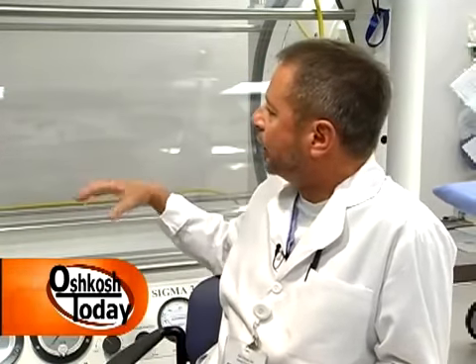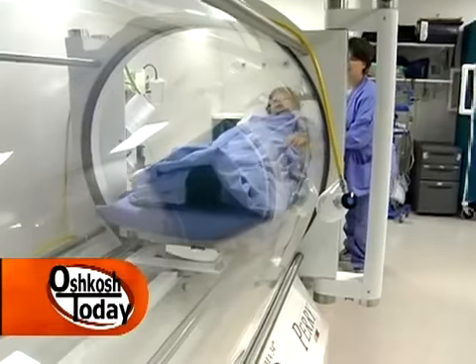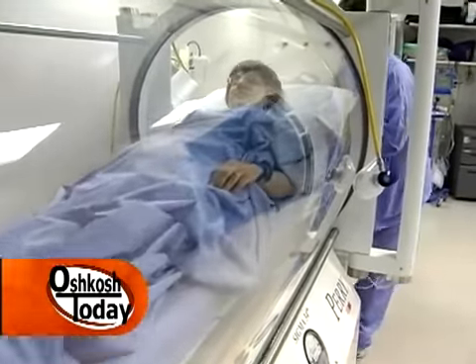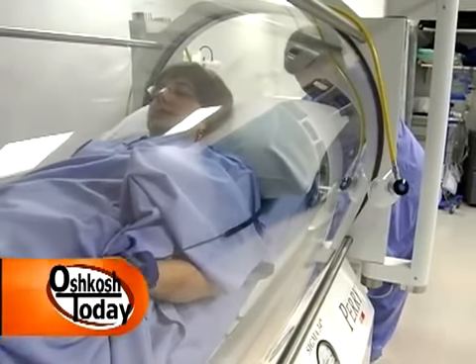Joining us now to discuss hyperbaric oxygen therapy is Dr. Jack Tissanai. Thanks for joining us. Can you just kind of give us an overview of what is hyperbaric oxygen therapy? This is a monoplace chamber. There are also multi-place chambers, and basically the patient is laying down and he gets put at pure oxygen to a depth of 2 to 3 atmospheres of pressure.